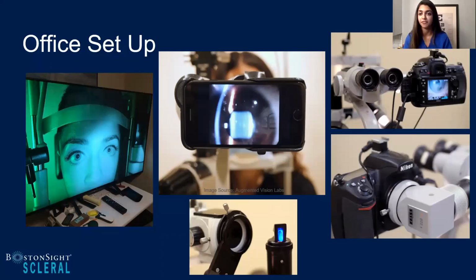So really taking a film of your patient's image can capture a lot of movement. And there's the beauty of why videos oftentimes give you more information than just still images. But the reason why I also like these large flat screen TVs is for patient education, really being able to capture that image and then replaying it so that you can educate, whether it's your patient in their chair, their parent, their significant other, their caretaker.